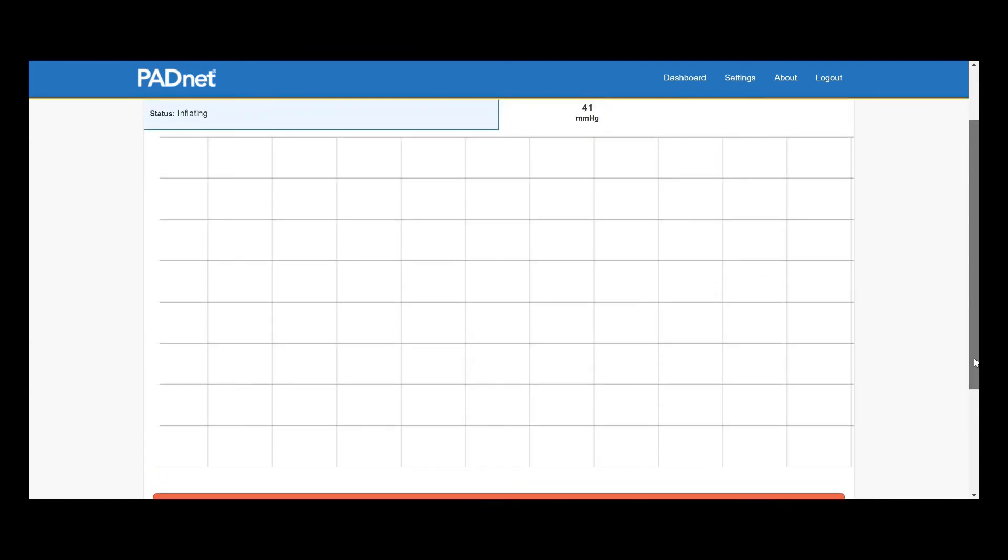Again, we scroll down, we'll click Start. We'll let the cuff inflate. It'll hover around that range. And once it finds a happy pressure where it can get an accurate reading of the volume of blood, it'll begin plotting on the graph.